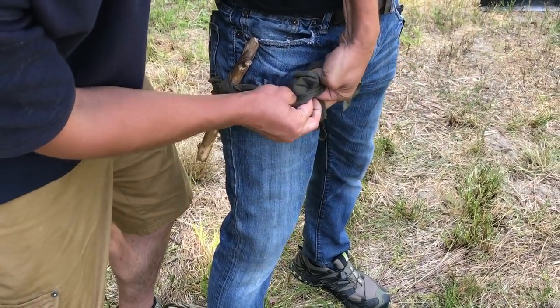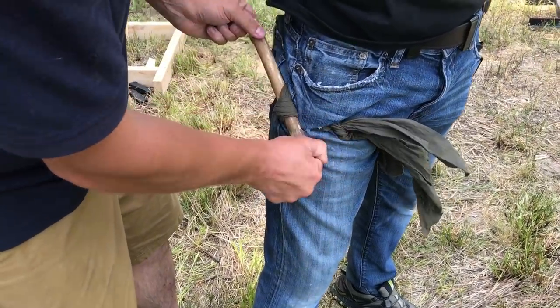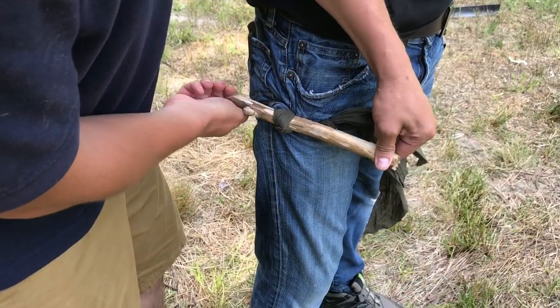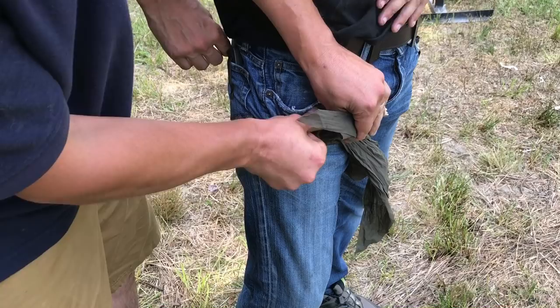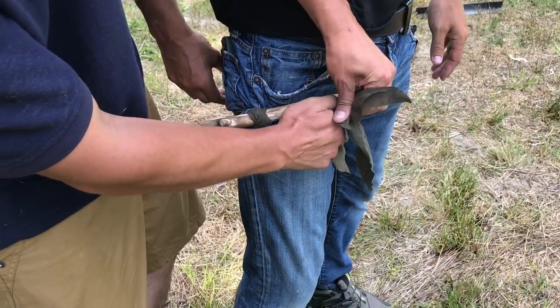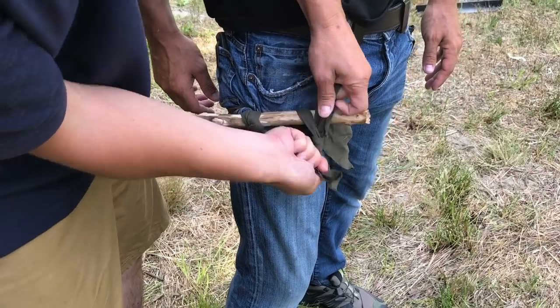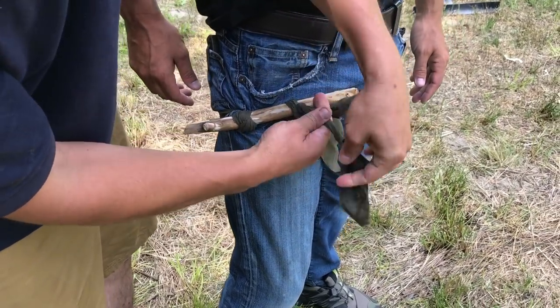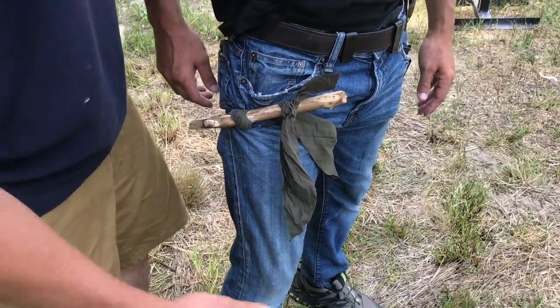Get my two throws. Just like the manufactured tourniquet, I'm going to turn this thing until I get hemorrhage control. You can already see we got a tremendous amount of pressure, but because I was smart with my knots, I can now secure this thing without losing any pressure. And this will stay in place until a higher echelon of care comes to relieve you.